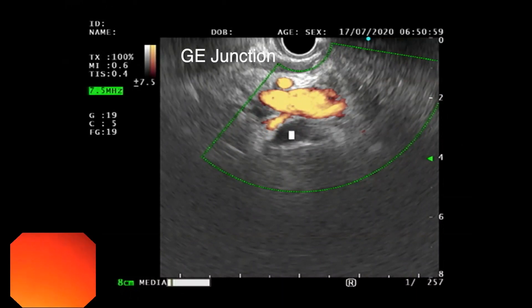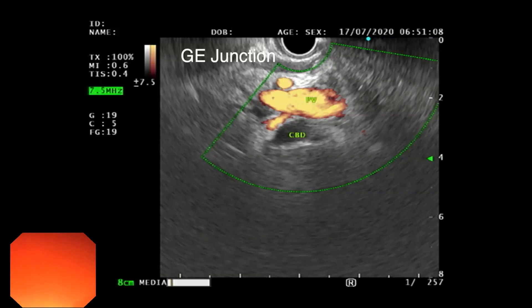It is particularly very easy to see the CBD from the GE junction if it is dilated. The above structure is the hepatic artery, the middle one is the portal vein, and the below one is the CBD.